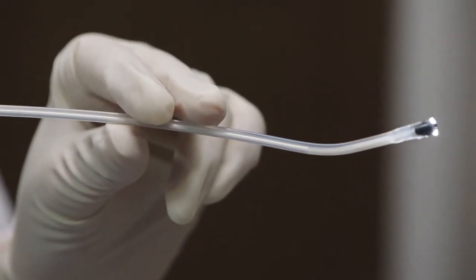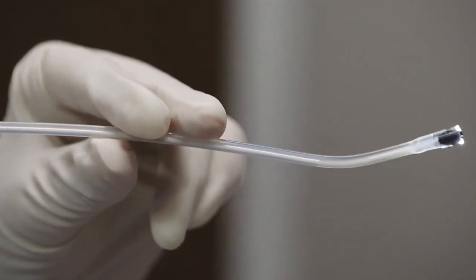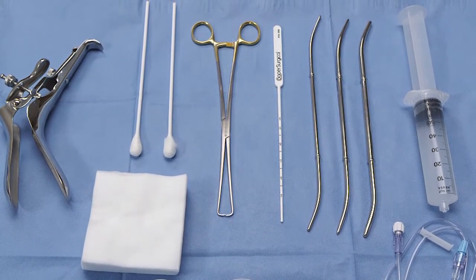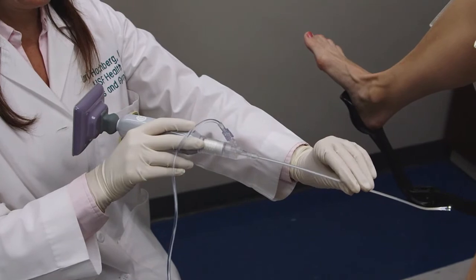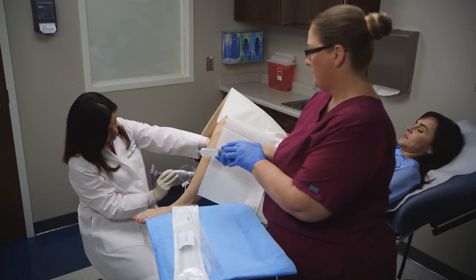The EndoC cannula is less than five millimeters in diameter, similar to a pipel. The need for dilation, anesthesia, or anti-anxiety medication for patient comfort should be decided on a case-by-case basis. The cannula is flexible, so depending on the patient's anatomy, a tenaculum may help you stabilize the cervix and align the cervical canal with the uterine cavity. If you have difficulty maneuvering EndoC due to a tight cervical canal, it is helpful to use your non-dominant hand to hold the cannula near the vaginal introitus to help rotate the device and guide it in.